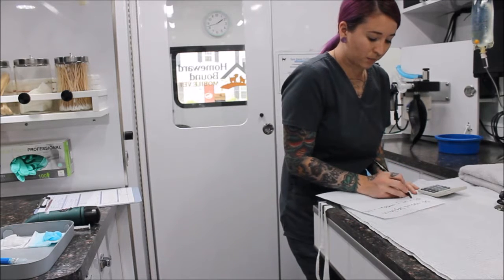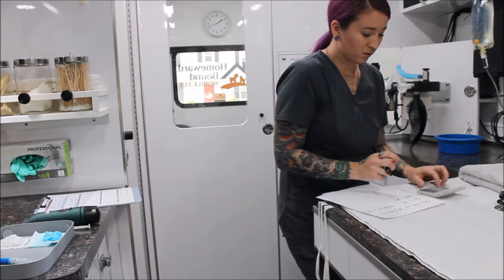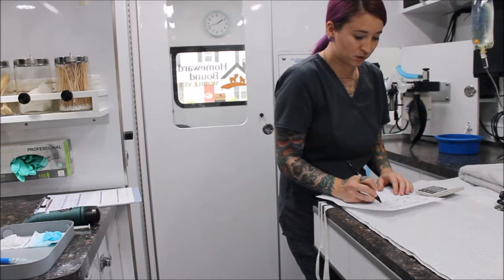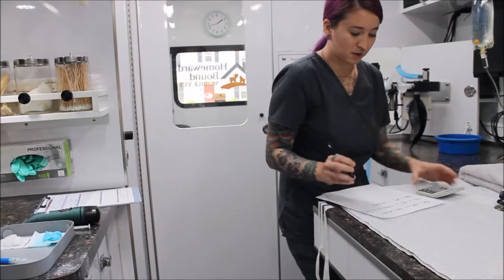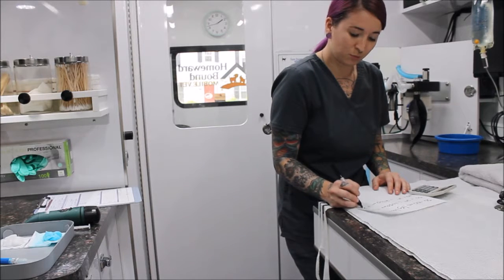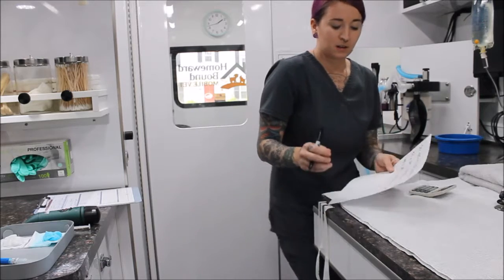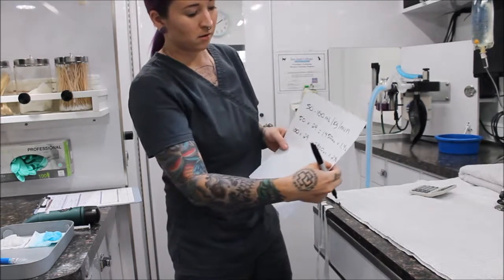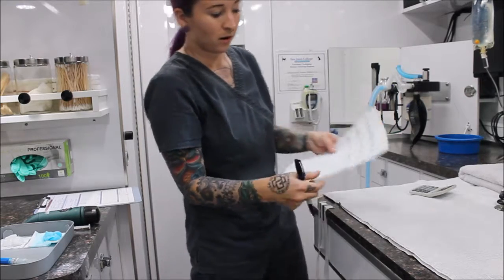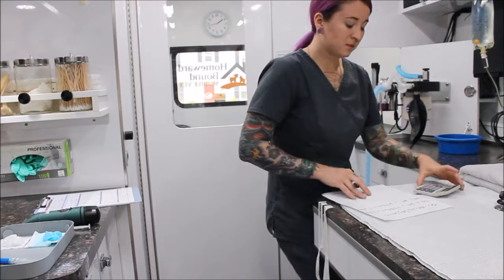And then for the 100, we'll do 100 times 29, which is 2,900 milliliters, which is 2.9 liters per minute. So that would be his induction or recovery rate. So I have both of those. Usually we like to start at the lower end before the higher end, if that makes sense.